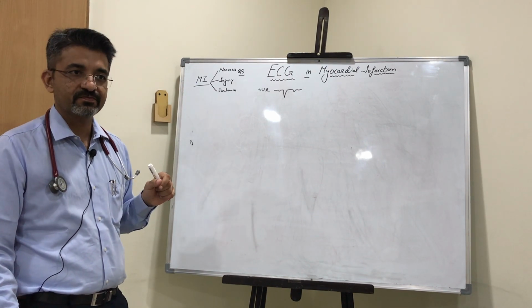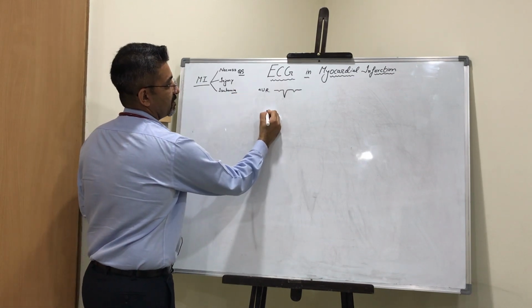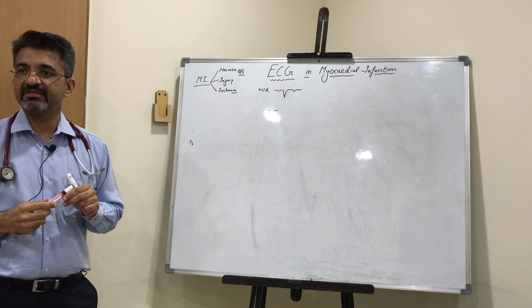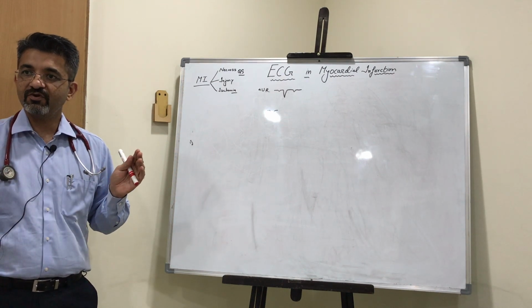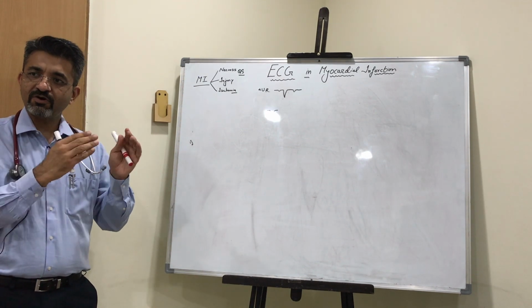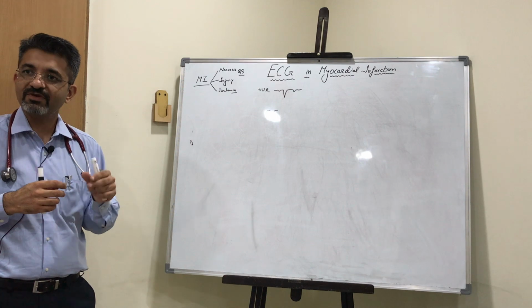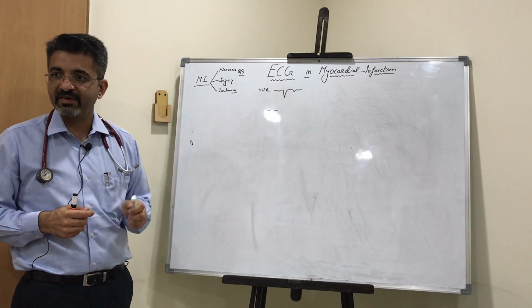Now we talk of T waves, right? When we are talking of T waves, we are talking of ischemia. The T wave is symmetrical, pointed and deep. Symmetrical, pointed, deep T inversions are indicative of not injury but an ischemic process around the area of myocardial necrosis, right? It may not always be a part of ischemia. You can have LVH with strain, right? In LVH with strain, because of the strain of myocardial muscle, you can have ischemic zones. There you can find similar T waves which are found in a case of MI, right?